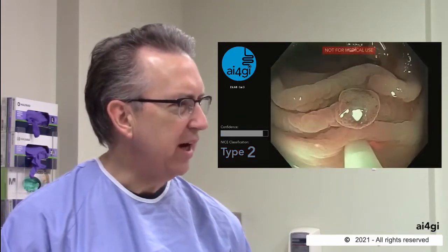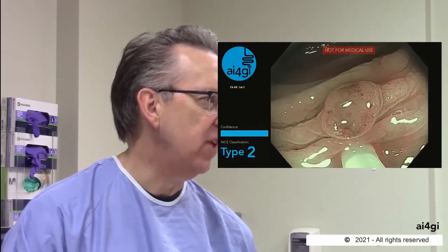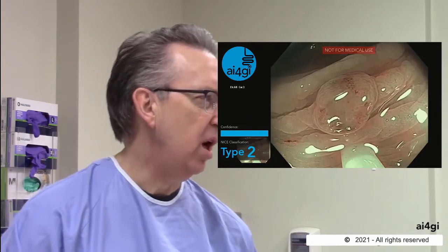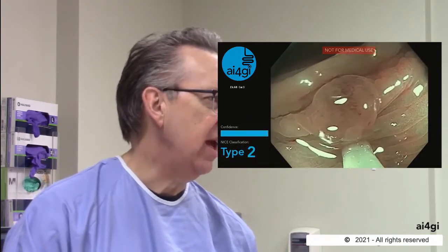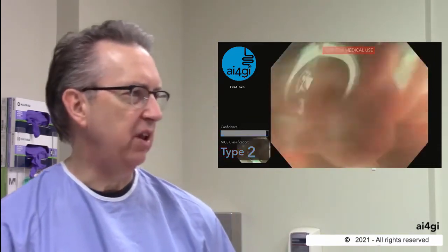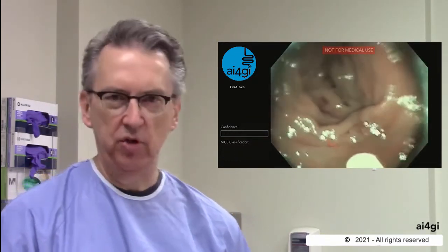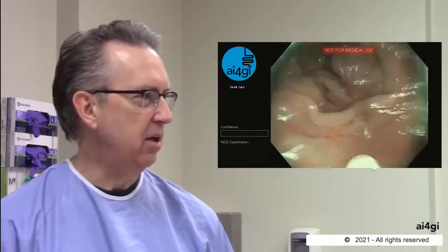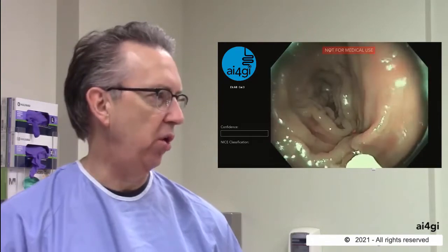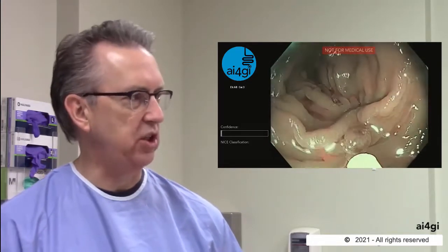I'm just going to try to get in here close to verify that that's the case. I do think that the surface pit structure is primarily tubular — definitely a type 2 lesion. The program knew that before I did, but I would agree that this is a nice type 2 lesion, a conventional adenoma. We're in the sigmoid, so we'll go ahead and remove this lesion.